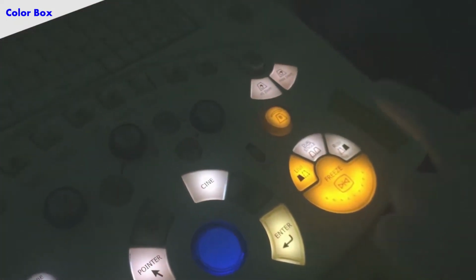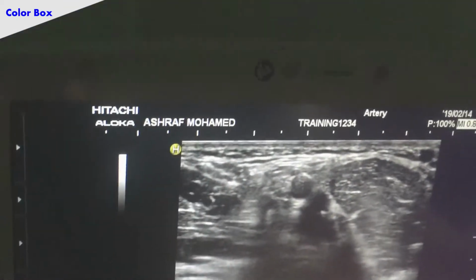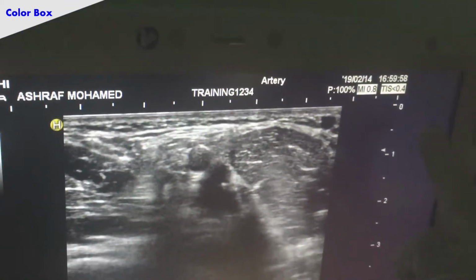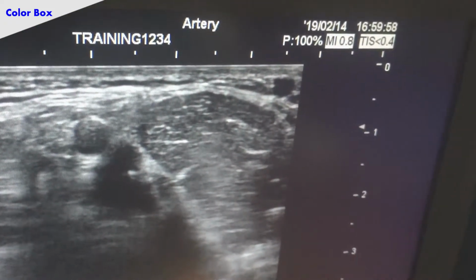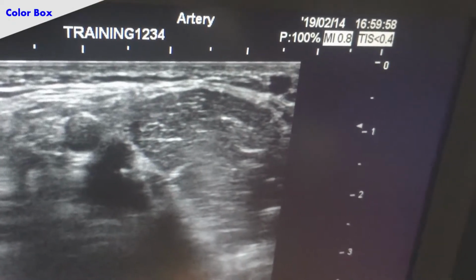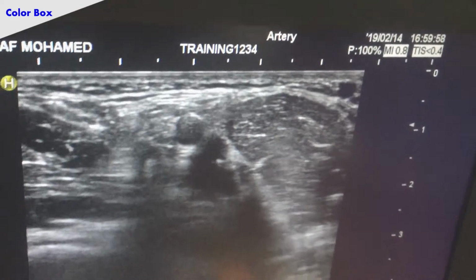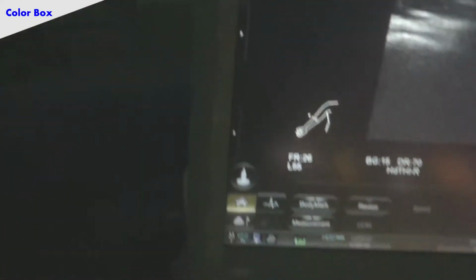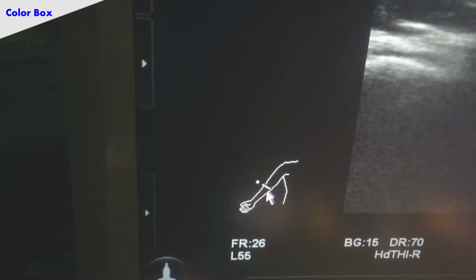I will push. Even here it was appearing at this point. Fix your camera here, please. Yes, look, I will make the recording. Now it is recorded to the machine. Okay, it is saved to the machine, but saved by what? Saved by this image, by this body marker here. Body marker please. Yes, this is the body mark.